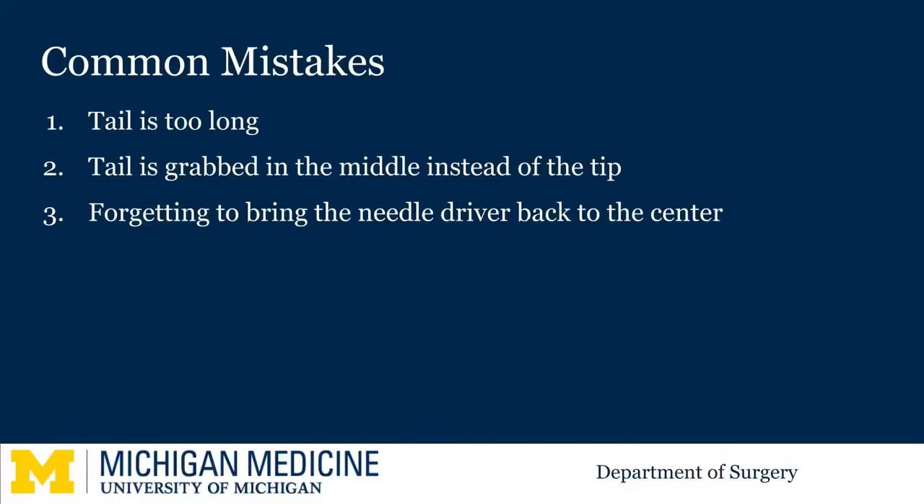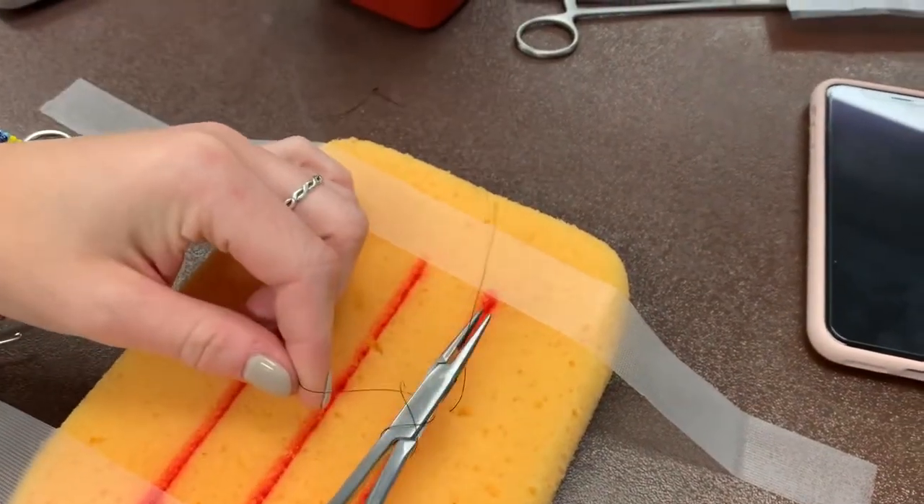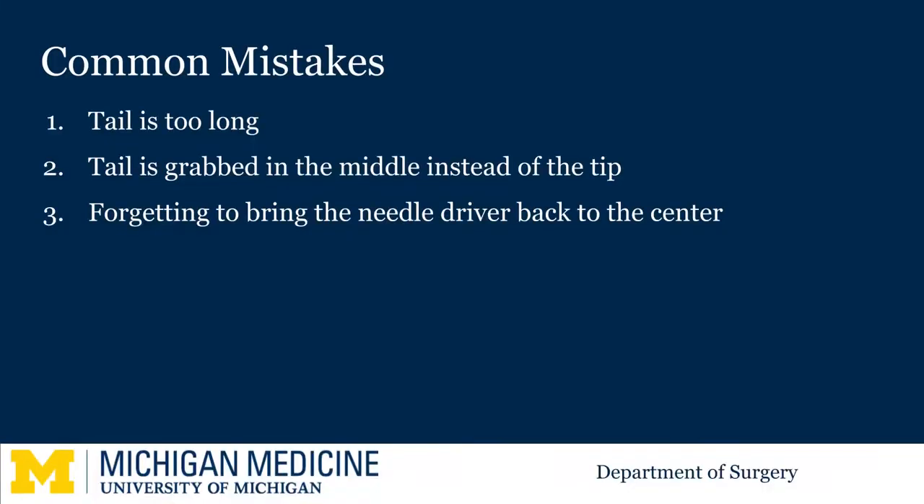Commonly students leave the tail too long or grab the tail in the middle instead of the tip. When this happens the suture tends to get trapped within the knot as seen here. Always remember to bring the needle driver back into the middle before the next throw.